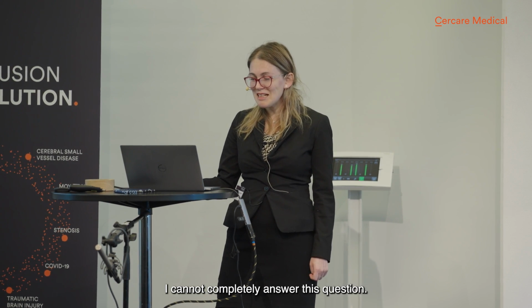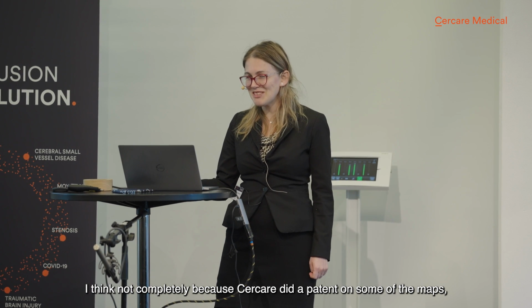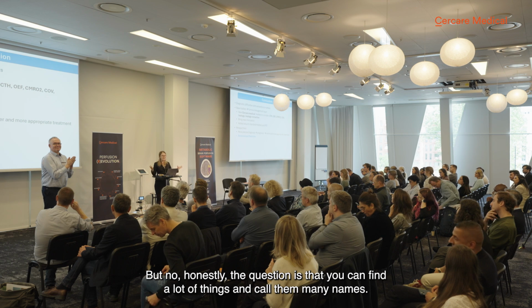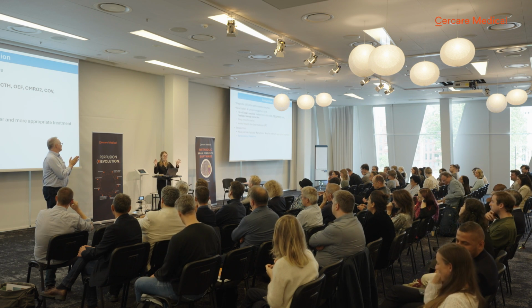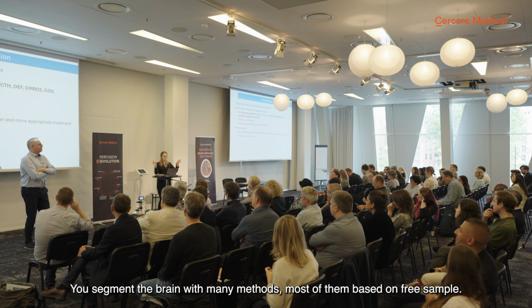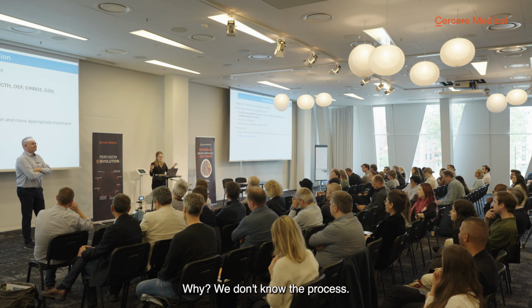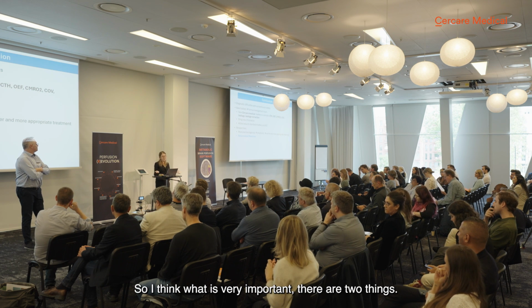I cannot completely answer this question. I think not completely, because the company did a patent on some of the maps. But honestly, you can find a lot of things and call them many names. Let's take an easy thing: the volumetry. You segment the brain with many methods, most of them based on FreeSurfer, and you take any method, and the volumes are completely different. Why? We don't know the processing. So I think there are two important things.